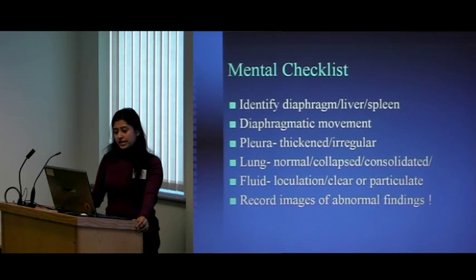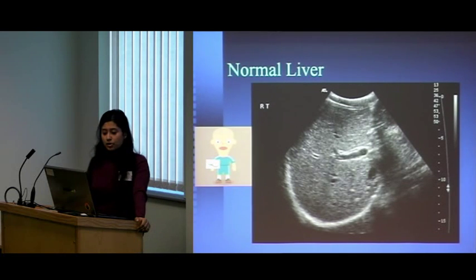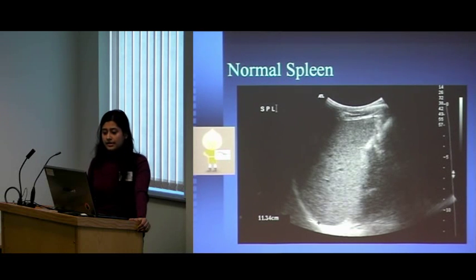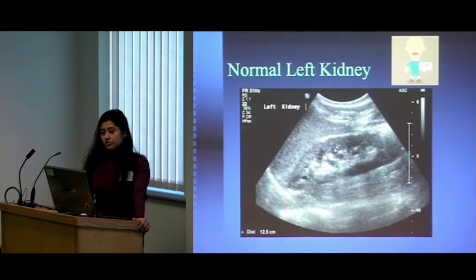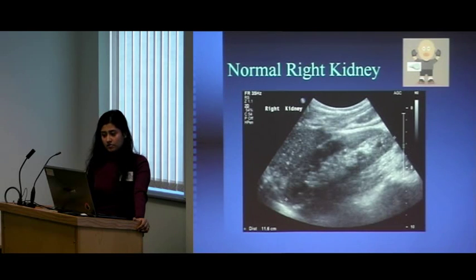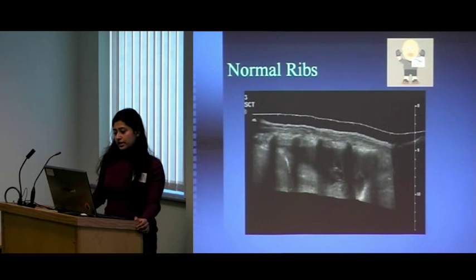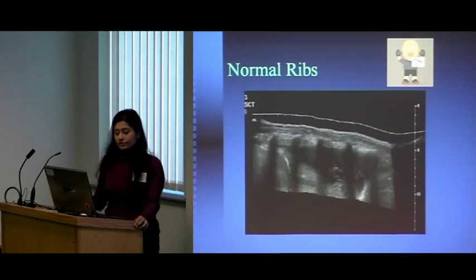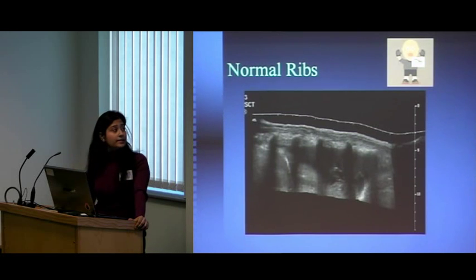Remember to take images of abnormal findings. Here are examples of normal structures: the liver, the normal spleen, the echogenic line of the diaphragm, the normal left kidney and spleen, the normal right kidney, and a panoramic view of the ribs sewn from multiple scans — you can see the ribs with the dark posterior acoustic shadowing behind them.